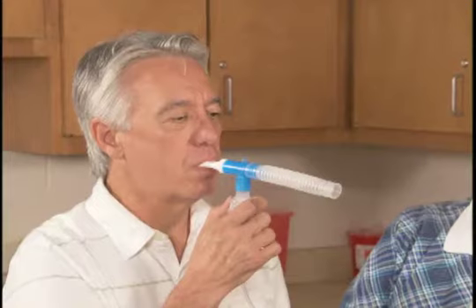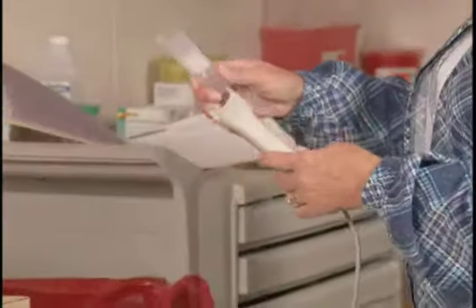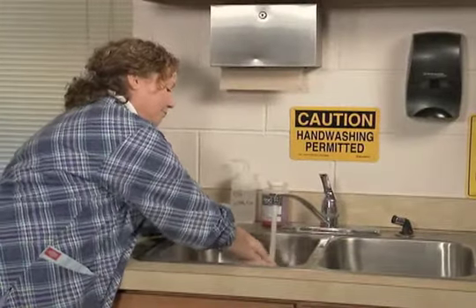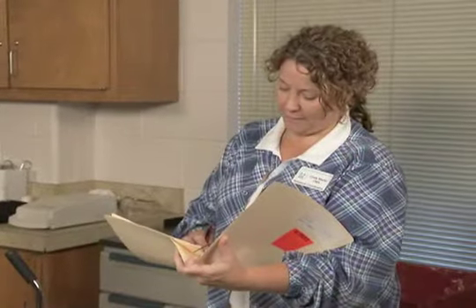When the treatment is over and the medication cup is empty, turn the machine off and have the patient remove the mouthpiece. Disconnect the disposable treatment setup and dispose of all parts in a biohazard container. Properly put away the machine. To finish up, wash your hands and document the procedure, including the patient's pulse before, during, and after the treatment.